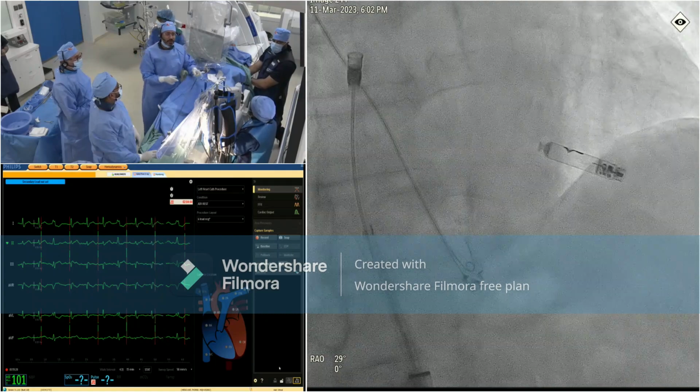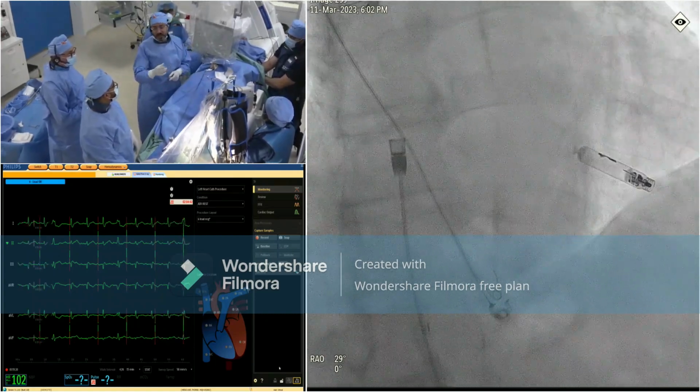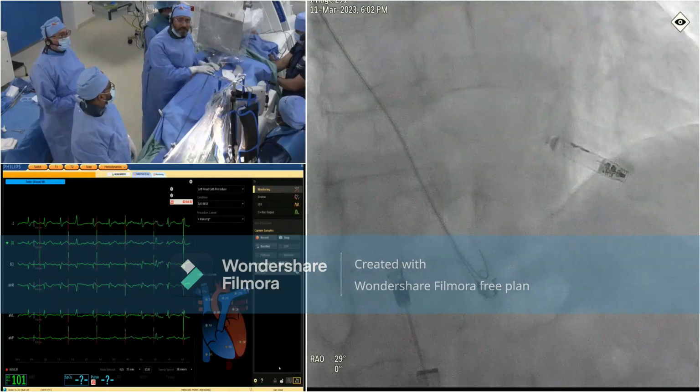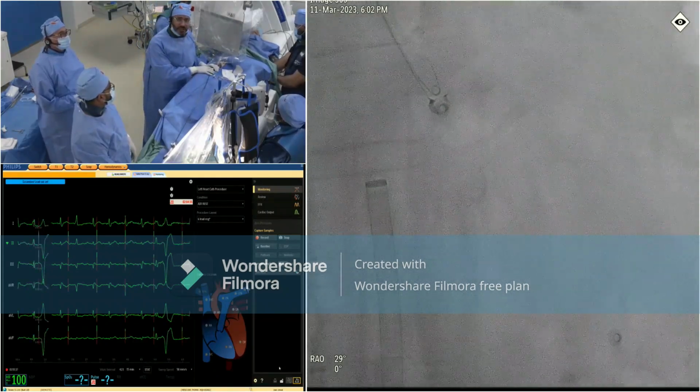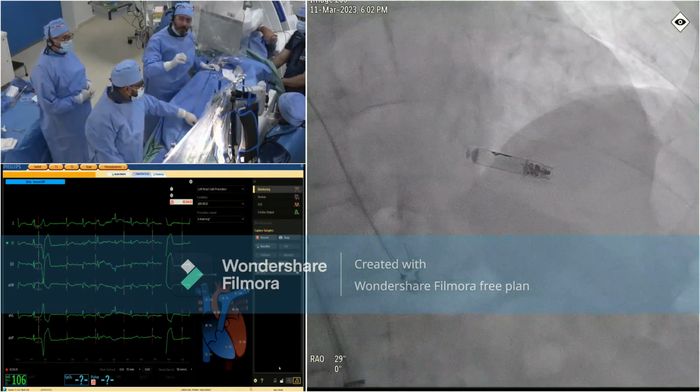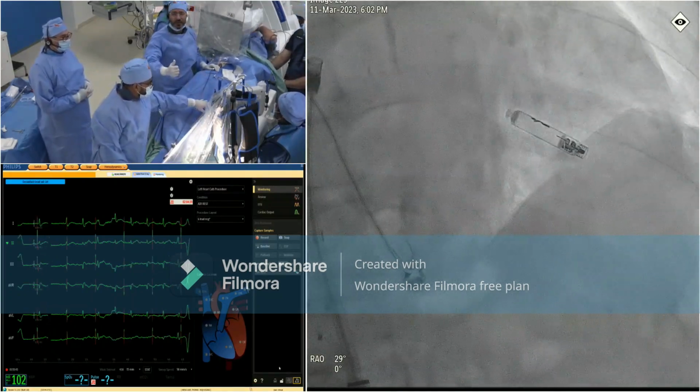But we have to keep an eye on the patient. Don't do the procedure and discharge the patient just like this the next morning. We have to follow up closely for the puncture site. Remember, this is a 27 French sheath, so this is very important. This is an elderly patient. From our experience, we came to know that we have to keep them hydrated because they forget to drink.